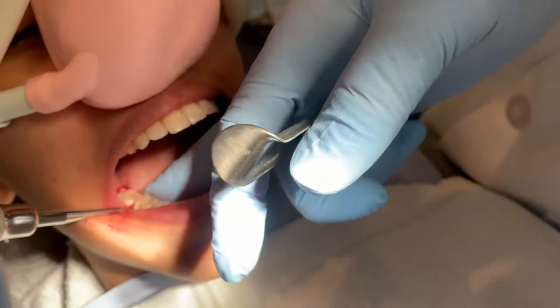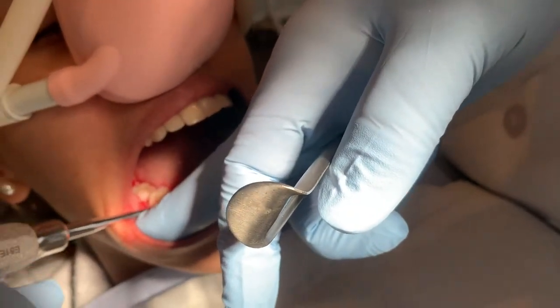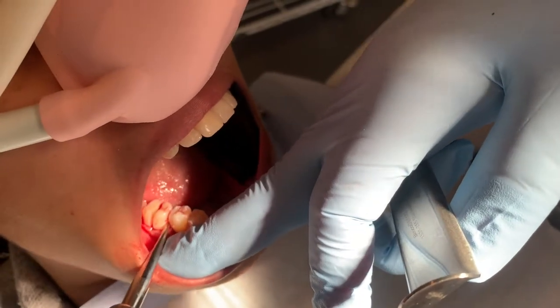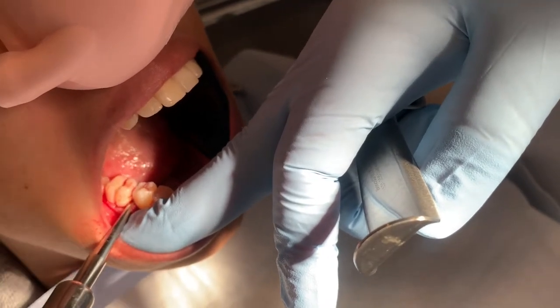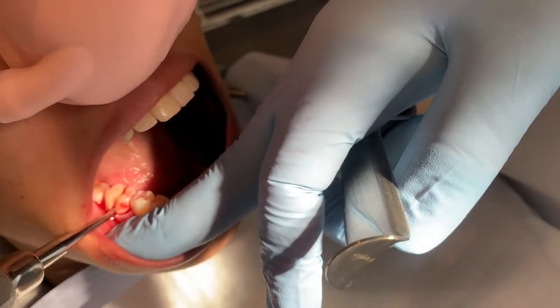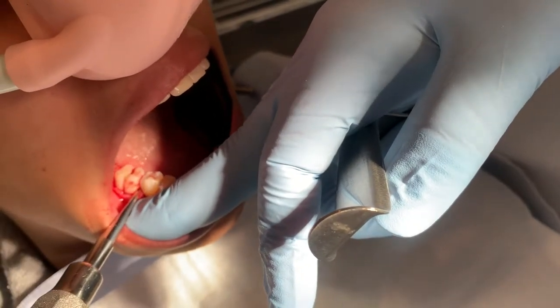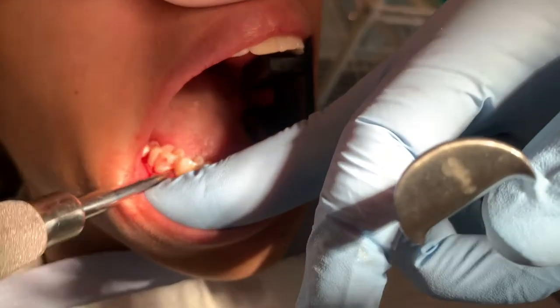Kind of go back here and get the other root moving. You don't want to put too much pressure on any of the other teeth. And the gum and the bone are a little bit flexible, so you can take advantage of that. Some people's bone is more flexible than others. It's not hurting, right? Mm-mm. Yeah, I think we almost got the first root out.